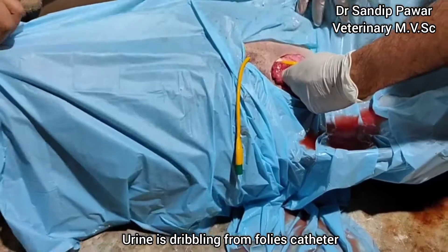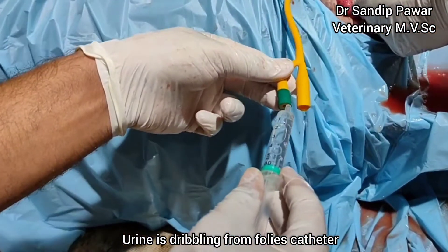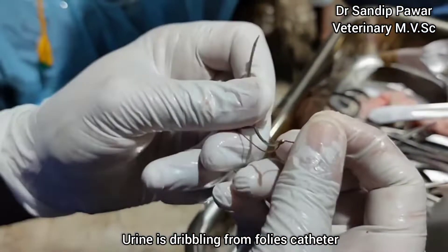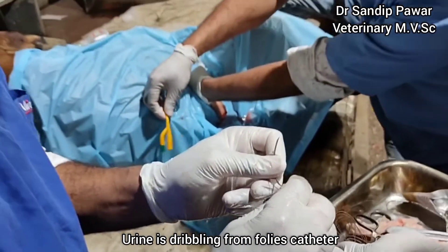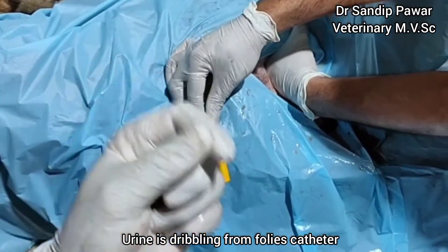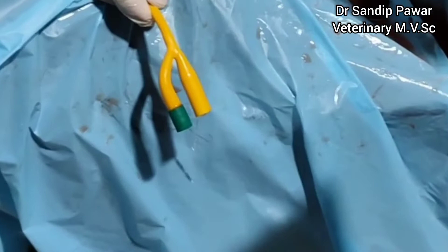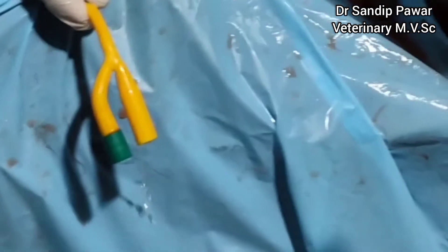After fixing the Foley's catheter in the urinary bladder, the dribbling of urine was observed. This ensured that the Foley's catheter was properly fixed and hence the catheter was working.